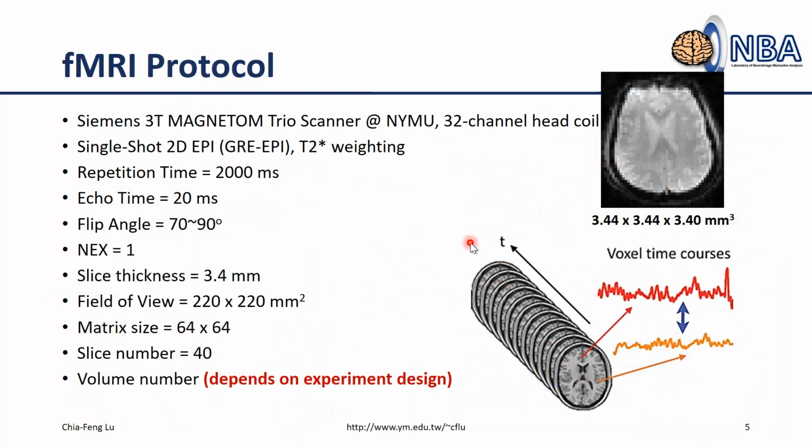I put this slide here because today we are again using the data that we acquired from our 3T MRI facility. We are going to use the resting-state fMRI, including 200 time points. All other parameters are listed here. If you want, just check these parameters.